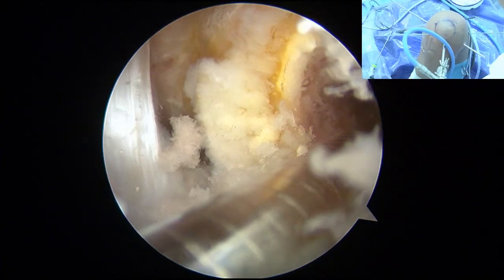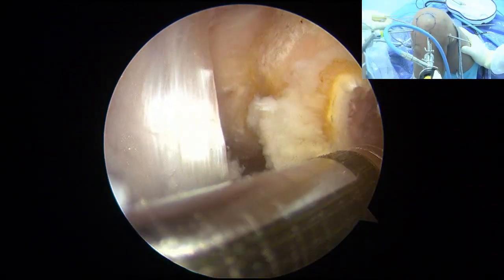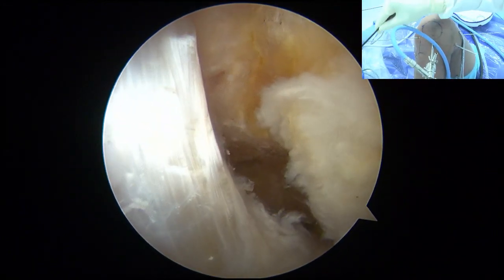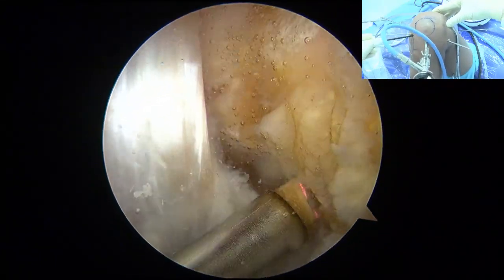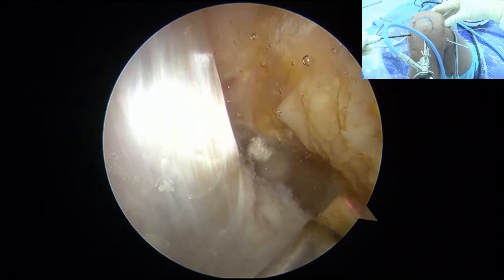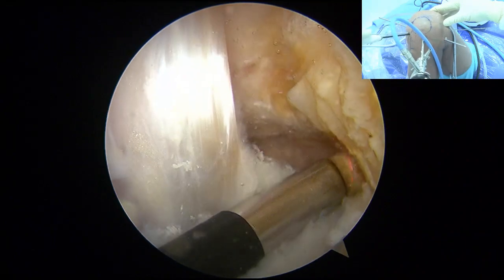Okay, the good thing about the smaller size is, I show you, you will not break the posterior cortex. You never break the posterior cortex, I tell you, using this technique, because when you do it this way, I show you here, give me RF. 那今天我们的粗隧道呢是20毫米，根据这个标本的大小来决定的。因为移植物还比较长，I show you the posterior cortex. 所以股侧可以有2公分。那直径方面呢是9毫米，我们先从小钻开始用，先用6号的，再扩成9的。那用这种方法呢，就能保护后方的皮质不会打穿。你们看到吗？这个 posterior cortex，后方皮质就这里了，yeah.